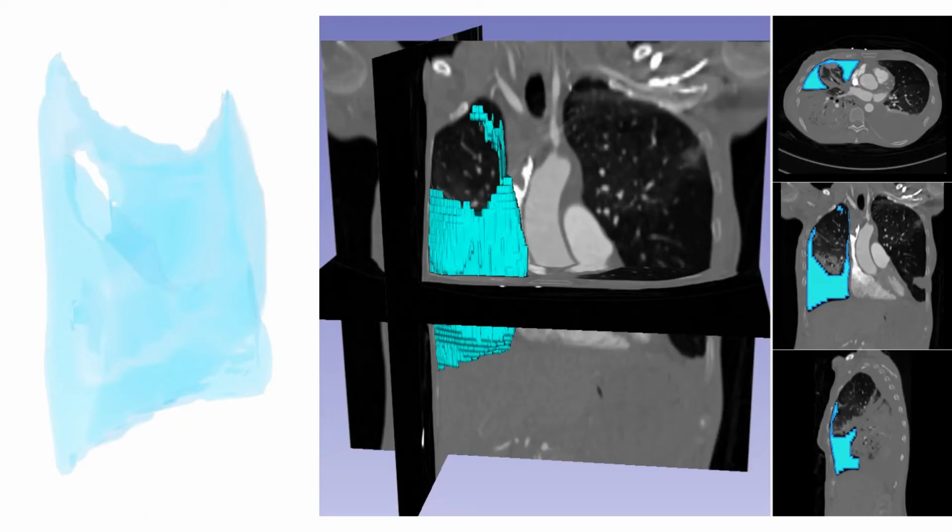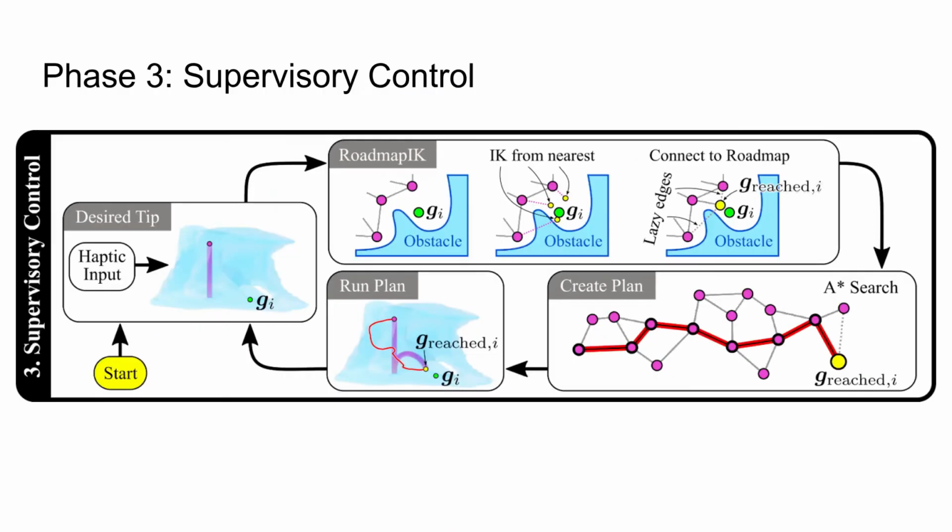Anatomical regions that are segmented from 3D medical images, like this CT scan, are already represented as voxel sets. Loading and pruning our roadmap is very efficient, taking less than 1 second for our roadmap of 30,000 vertices and 570,000 edges. The last phase is supervisory control.